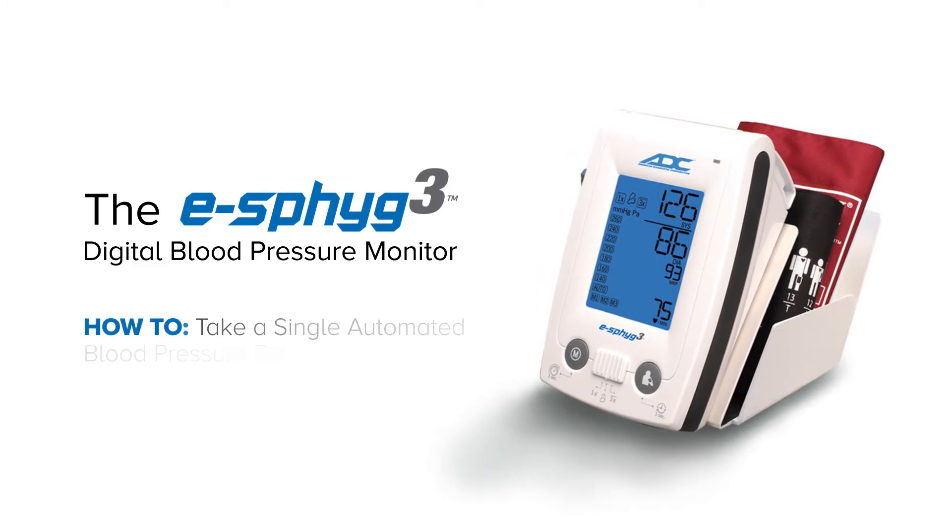In this video, we'll show you how to take a single automated blood pressure reading using the default settings.